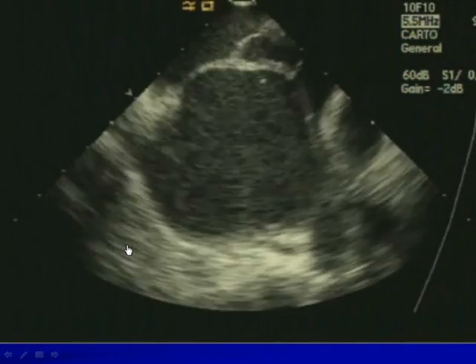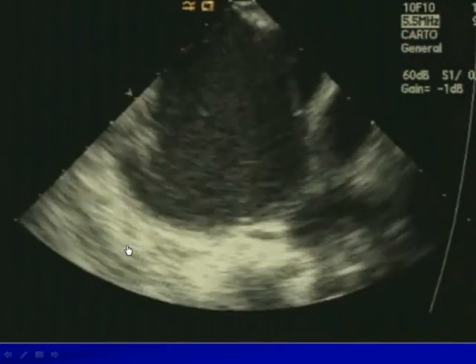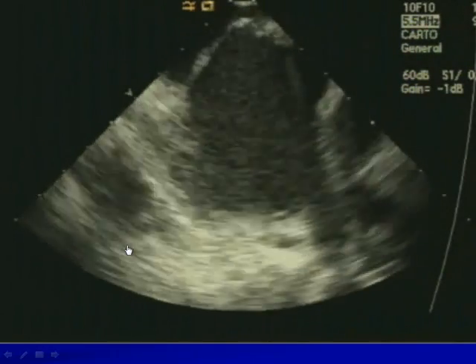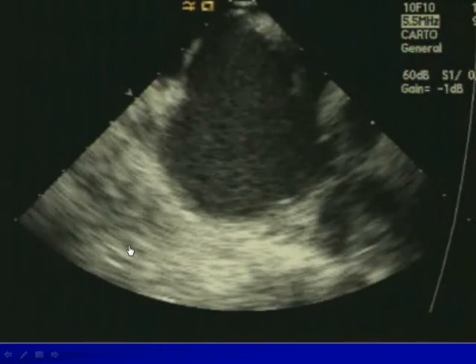See how far over to the contralateral side the septum goes. Okay, they would trust you. The point I want to make is that if you don't recognize and appreciate the differences in the interatrial septum and the aneurysmal septum, you very easily tent all the way across to the contralateral side before you've even gone transseptal.